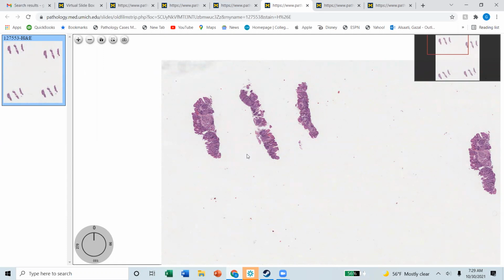However, the biopsy from the body will be quote unquote antralized. That means the oxyntic mucosa that's supposed to be within the body is lost because of the antibodies against the intrinsic factor that will cause atrophy of these oxyntic glands and then loss of them. So we call it antralized type mucosa or atrophic body type mucosa.